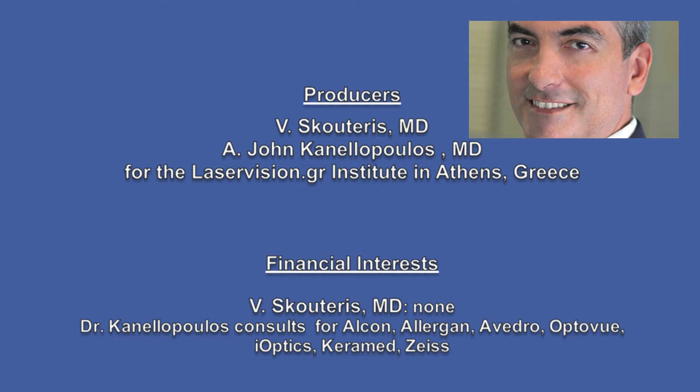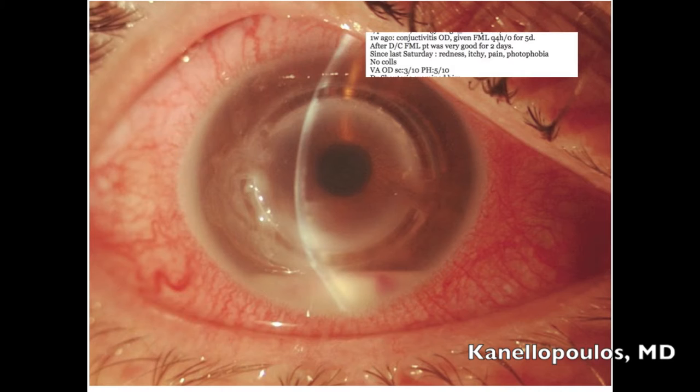This is a young gentleman who about 16 years ago had successful INTACS placed, as you can see here, horizontally for keratoconus. He did very well. It was just this eye treated; the other eye was good, uncorrected.